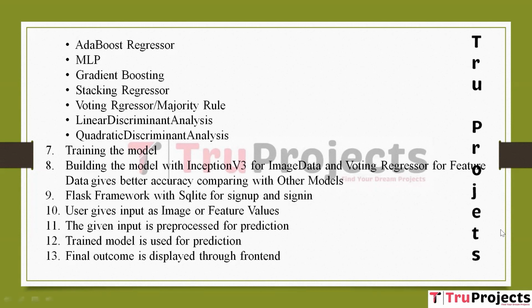The results of the prediction, whether it's a classification, presence or absence of sleep apnea, or a regression, quantitative prediction, are presented to the user through a user-friendly front-end interface. This can include visualizations, text-based results, or other informative feedback, making the system accessible and interpretable for users.